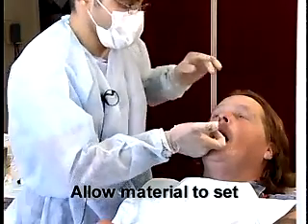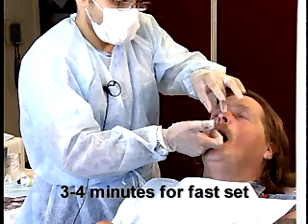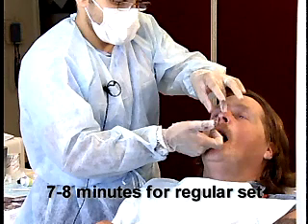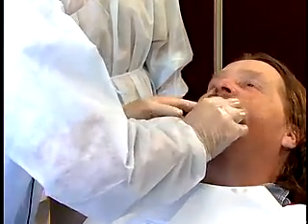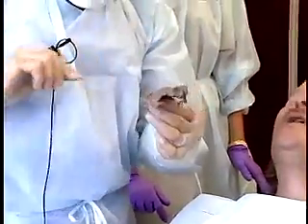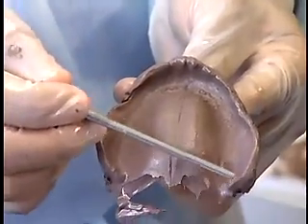Allow the material to set. Generally, this is 3 to 4 minutes for fast set rubber base and 7 to 8 minutes for regular set rubber base. Remove the maxillary final impression. Inspect the impression to determine if it's acceptable.